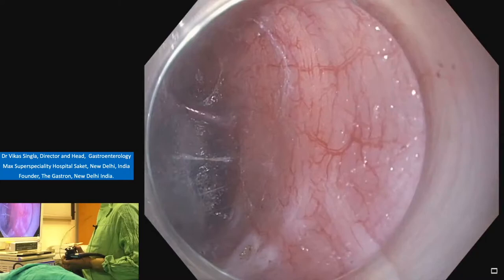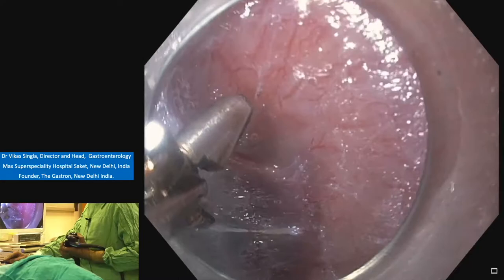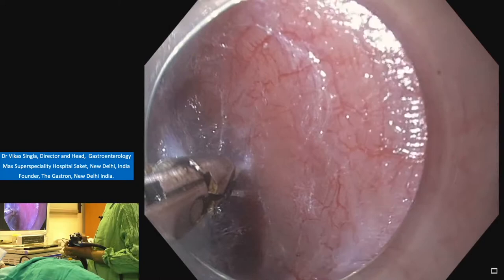So first we go inside. Open. And then we grab the vessel. Grab the vessel. Pull it back. And then use the soft coagulation, 60 watts, effect 3. Once it becomes white, we cut the vessel.